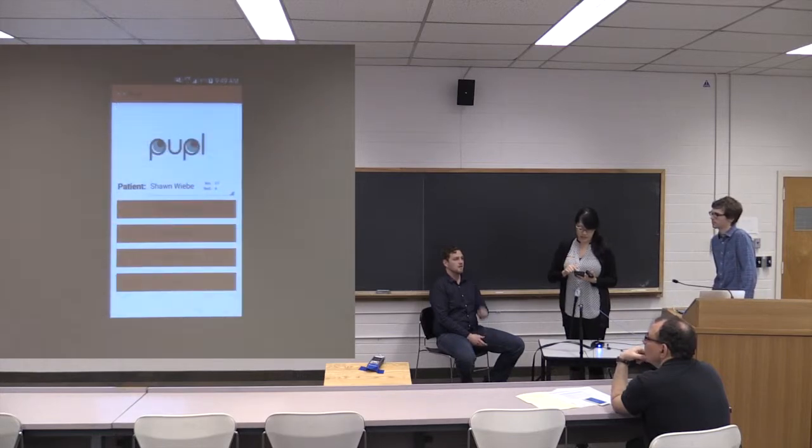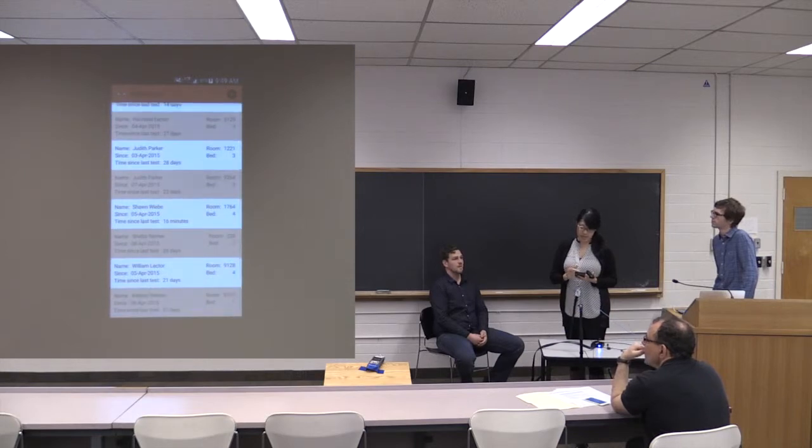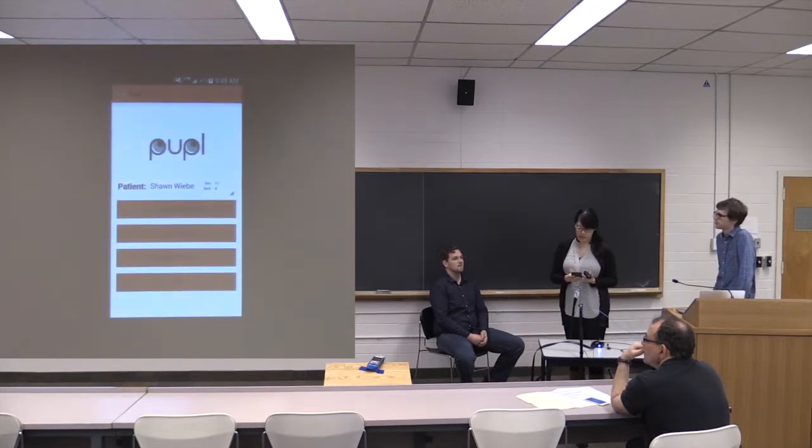Here he is. We can also see when he last did his test, which is helpful, 15 minutes ago, but we'll do it again now. We can also move through this quick drop menu to make sure that we're with the right patient. So I'm going to go right into the test center.